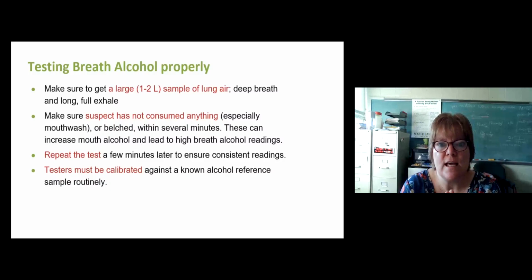So if you want to test the breath alcohol properly, it's important to get a good measurement. And to get a good measurement, one, it has to be a very large sample, 1 to 2 liters. So think about a 2-liter bottle of soda. That much breath, as you just inhale and exhale like that, is not nearly enough. So it has to be a big breath out. Deep breath, long, full exhale.